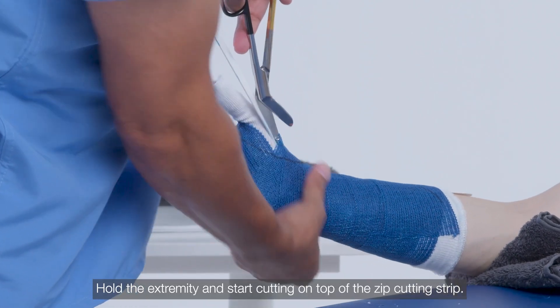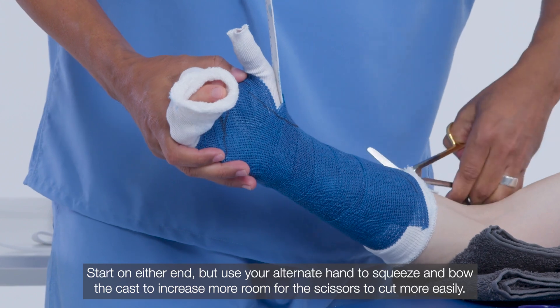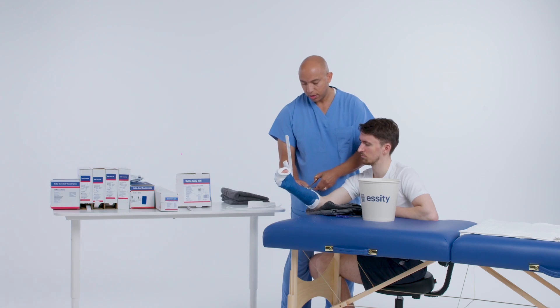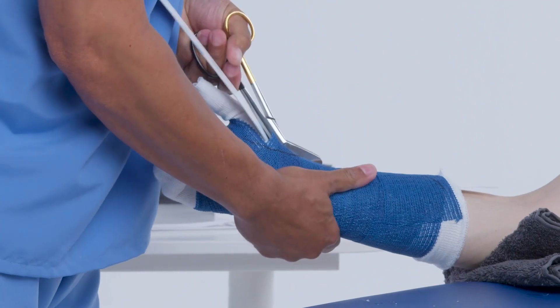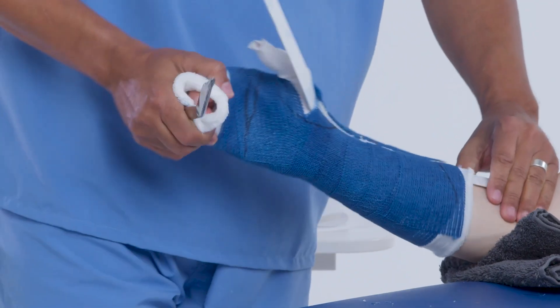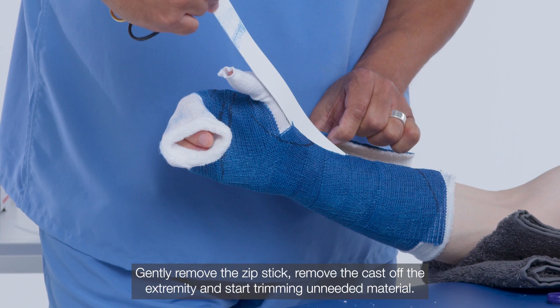Hold the extremity and start cutting on top of the zip cutting strip. Start on either end, but use your alternate hand to squeeze and bow the cast to increase room for the scissors to cut more easily. Gently remove the zip stick, remove the cast off the extremity, and start trimming unneeded material.